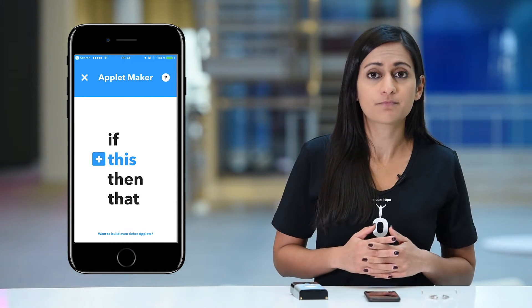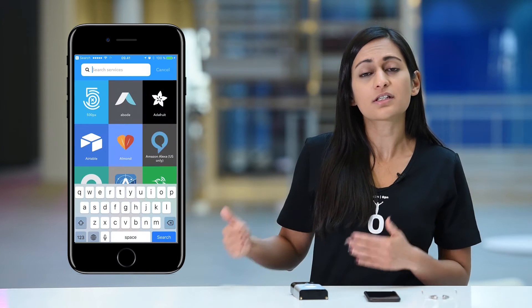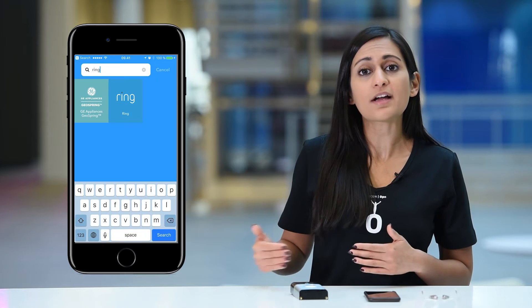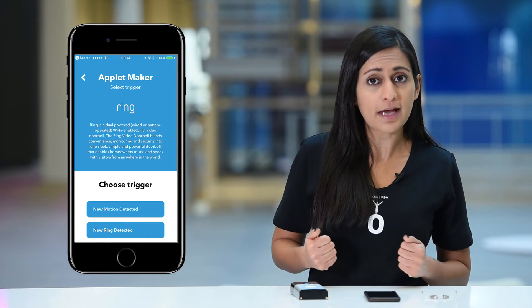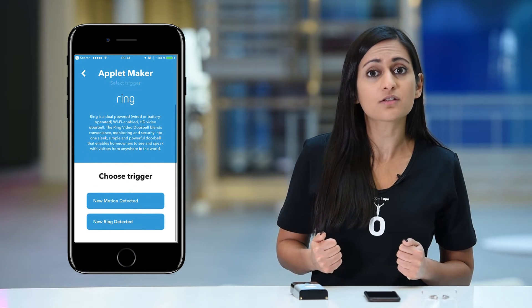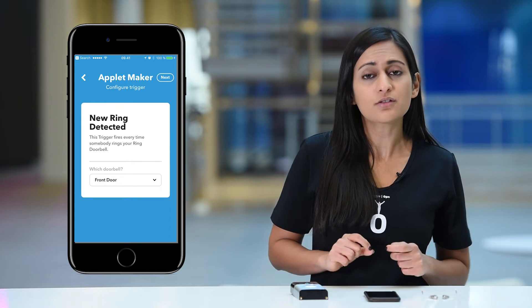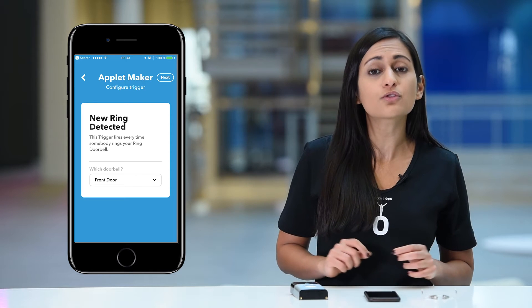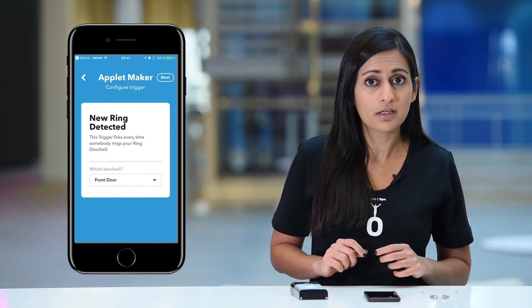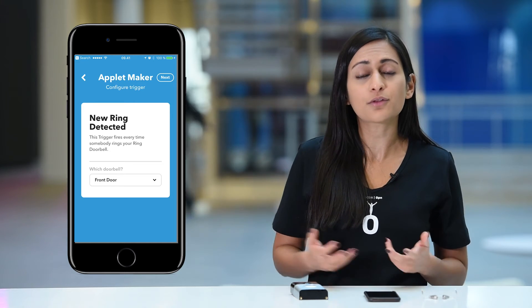Now we have to specify what we want the hearing aids to react upon. Tap the plus sign and search for Ring. I would like to hear when the doorbell is ringing, so I select New Ring Detected. If this is the first time you've created an applet with the doorbell, the IFTTT system will need to know how to connect to your particular doorbell. To enable this connection, simply tap Connect and enter the account information you used when creating the Ring account. This way, you'll allow IFTTT to connect to your doorbell and get the ringing notification.